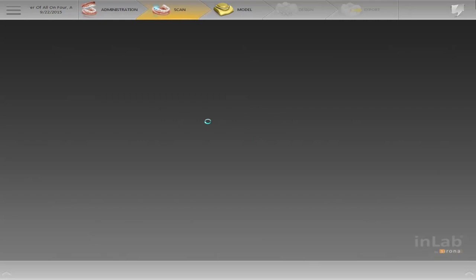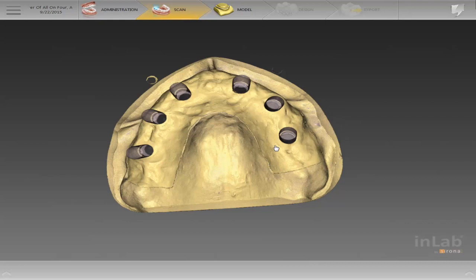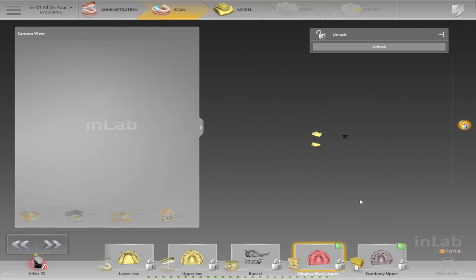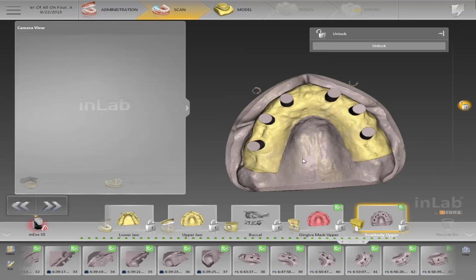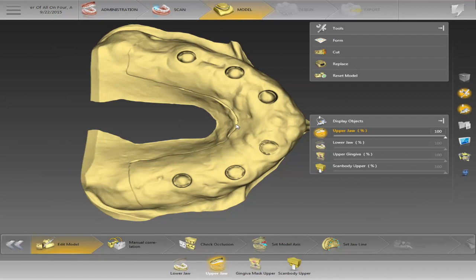Once it opens up, on the bottom you'll see I have a couple of different catalogs: the lower jaw, the upper jaw — which I don't use scan bodies on, it's just the model — my buccal bite, and then I scan in my gingiva. Lastly, I scan my scan bodies. As I said, with NT Trading all you really need to buy is one — it's called an ImPost, you can get that from Zon.